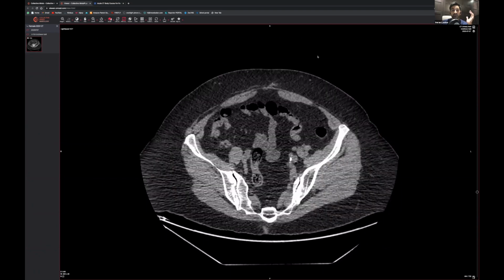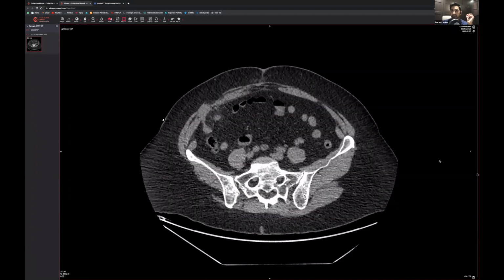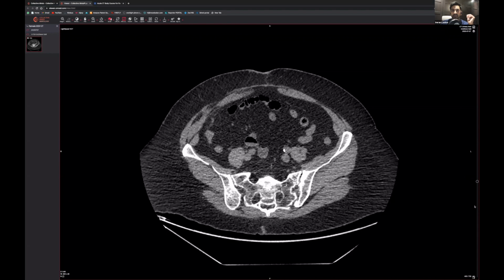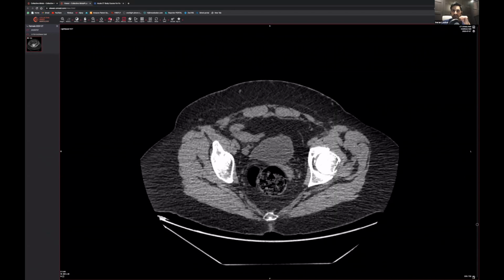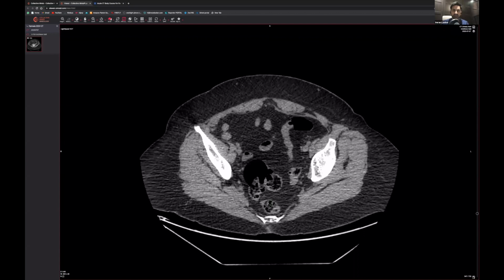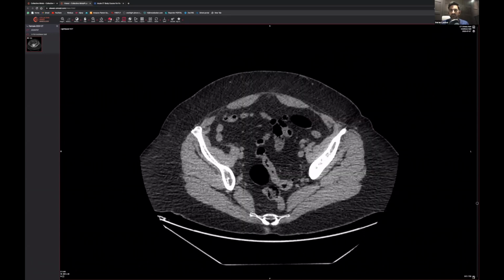So that looks like we don't have a kidney stone. We don't have anything like that going on. So that's good news. So let's look at the bowel. Follow our way up. So bowel is here. Follow along like so. Follow my mouse. Follow my mouse. Where are we?